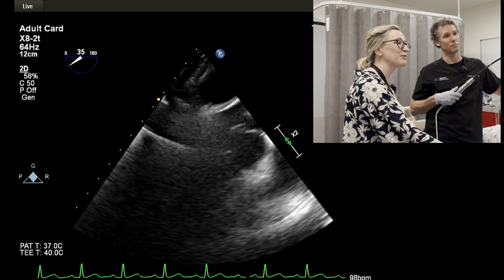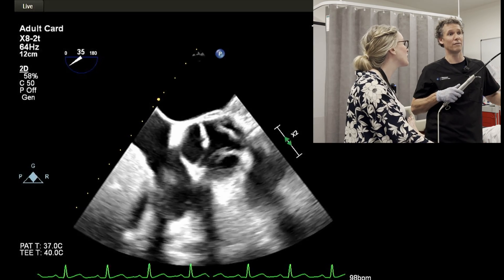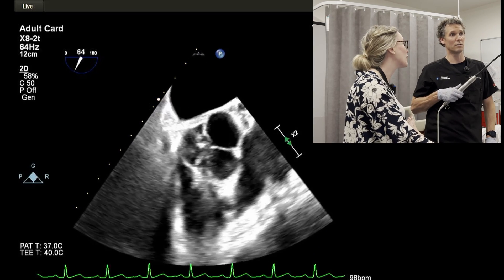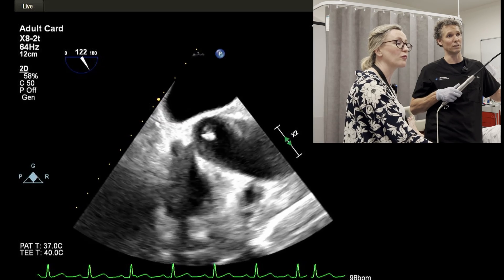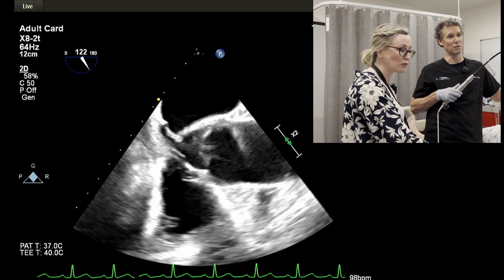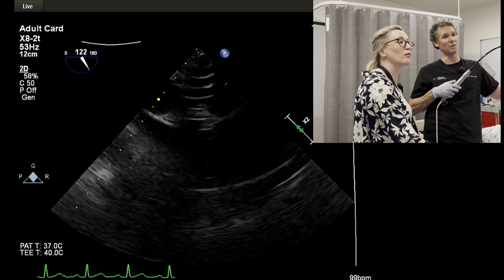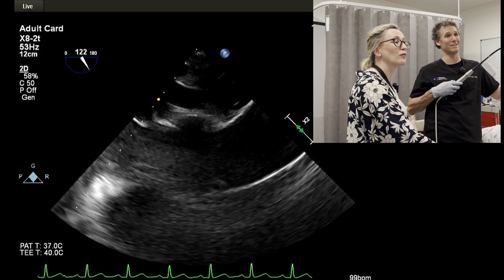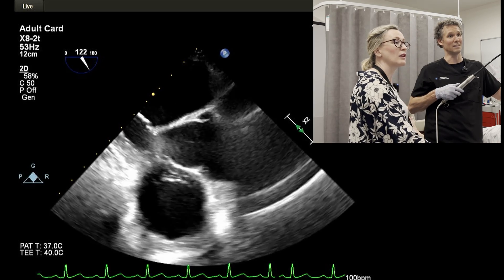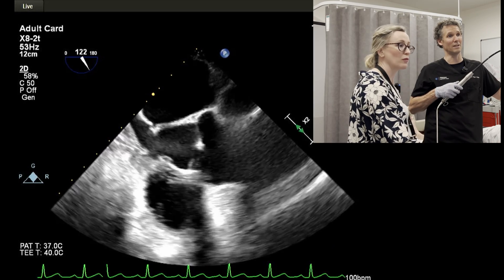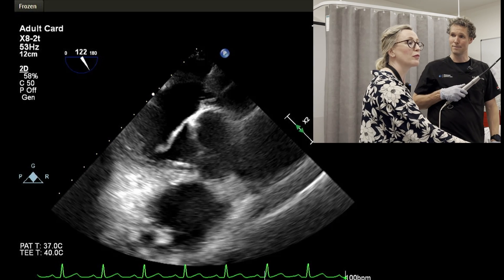An assessment of the aortic valve is not complete without an assessment of the aortic root. I'm going to go back to 120 for that. If I want to look at the aortic root because I'm in 120 degrees, I've now got to pull back. I'll increase the sector width, do a little bit of anti-flexion and a little bit of retroflexion, just trying to find the contact. And I think that's probably the best I'm going to get. Emma, thank you very much indeed. Thank you. Cheers.